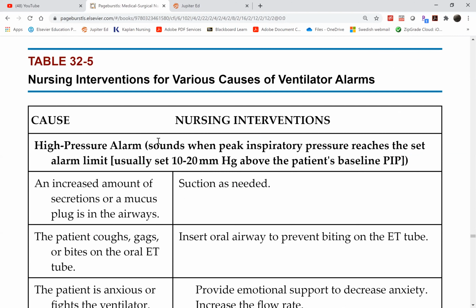Myself, I'm also guilty of alarm fatigue because over time, when the alarm keeps going off and you check it, it's really nothing, it's just certain changes in the patient's airway diameter, wherein the high pressure alarm keeps going off because you already suctioned the patient, nothing's wrong. You tend to ignore it, just like the boy who cried wolf.